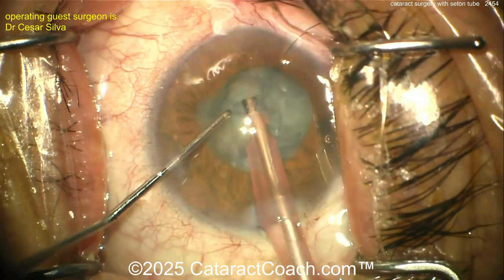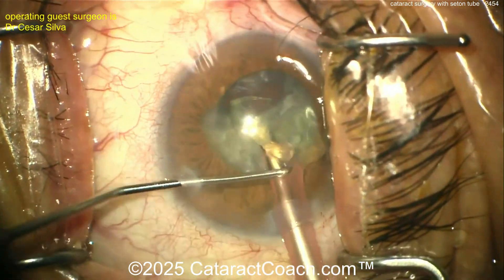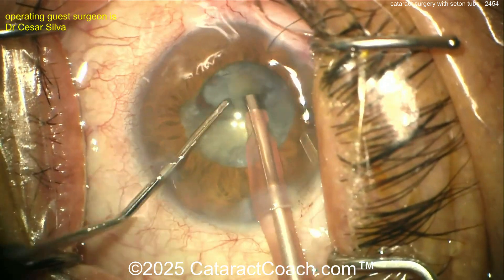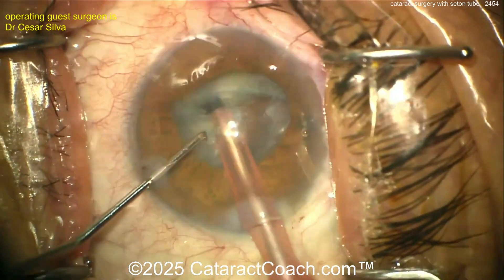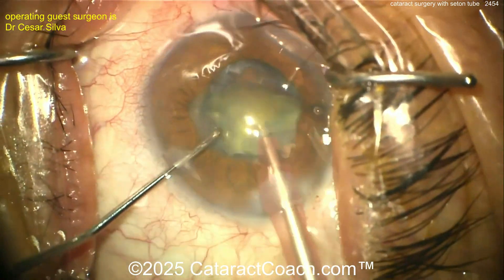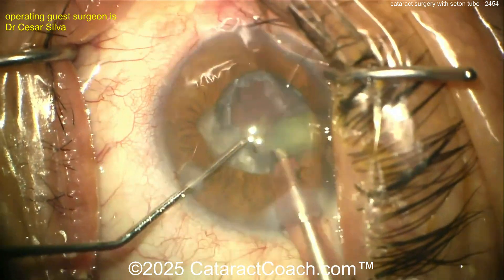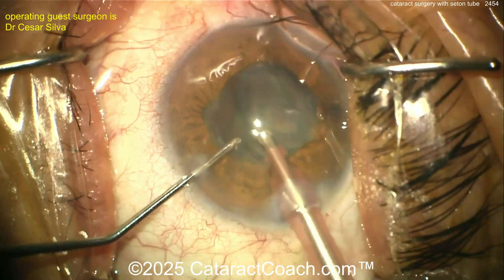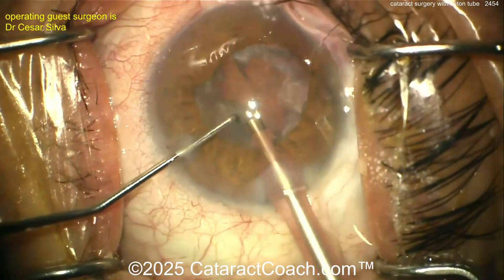I like this chop technique — beautifully done, great job by the surgeon — to remove this nucleus. You may have more anterior chamber instability. Some surgeons like to block off that seton tube while surgery is being done, maybe put some viscoelastic around it, but you don't have to do all of that. You can do your case as regular — maybe increase the infusion pressure, maybe decrease your outflow. You're balancing inflow versus outflow fluid. If the seton increases outflow, increase inflow and also decrease aspiration through the phaco probe itself, and you'll have a lot more stability and control.